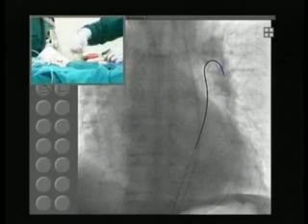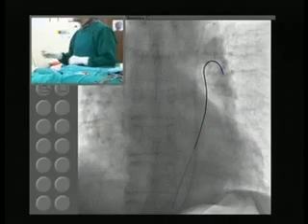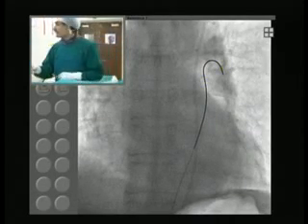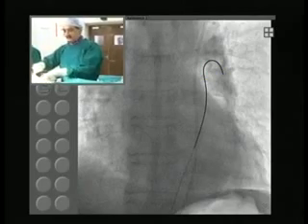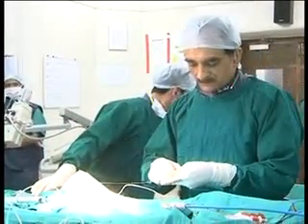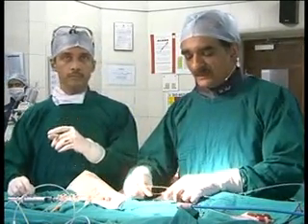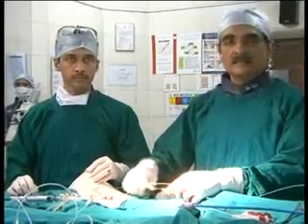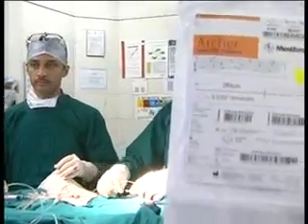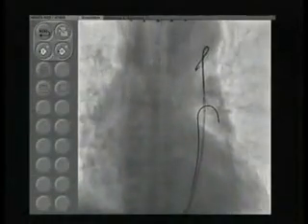Now Medtronic has their own wire now for all these sort of procedures. Mahesh, what's it called? Archer. You want to show the cover of that? Actually, till now we were using the Backup Meier from Boston Scientific. And can you show that? And also the Lunderquist from Cook. Okay, take that out. And bring the pigtail again.